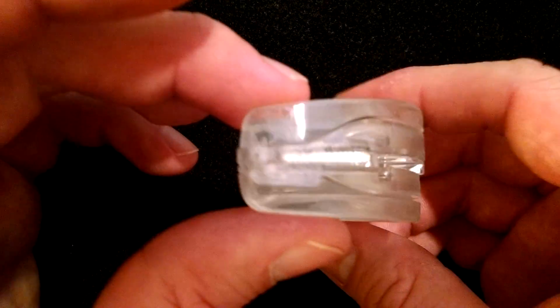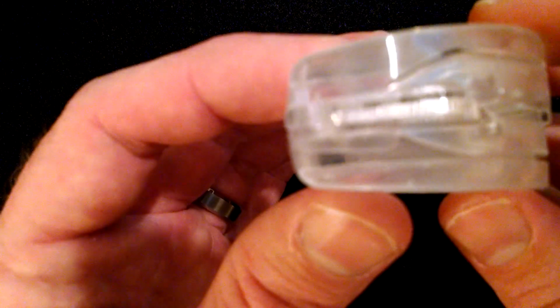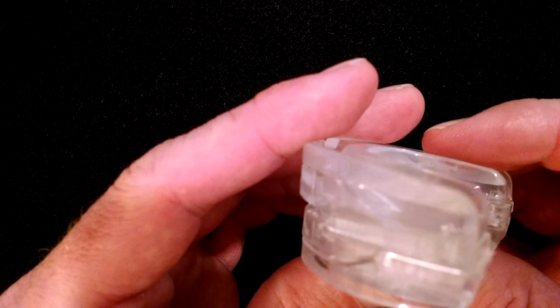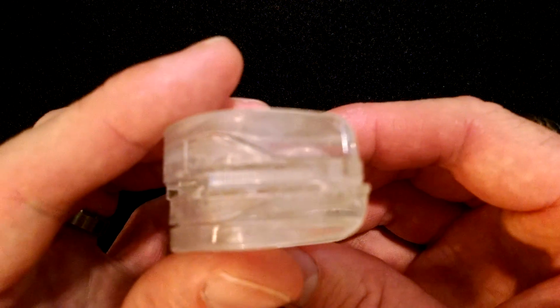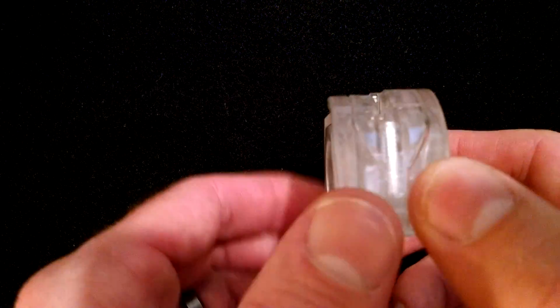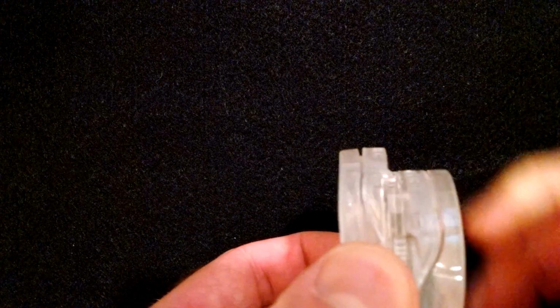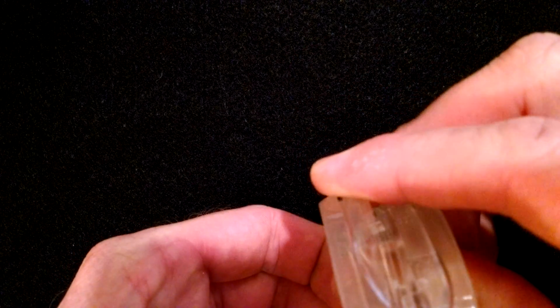Once you have created an impression, you can try it like this, but if you want to make an advancement adjustment, that's very simple. If you look here on the side, you might be able to see markings that show you exactly where to push. You really can't see it in this video right now, but basically you push on the lower tray like so, and that allows you to slide the advancement forward to whatever setting you need. This one's out quite a bit, so you might want to start with less of an advancement, and then progressively work your way forward if needed.